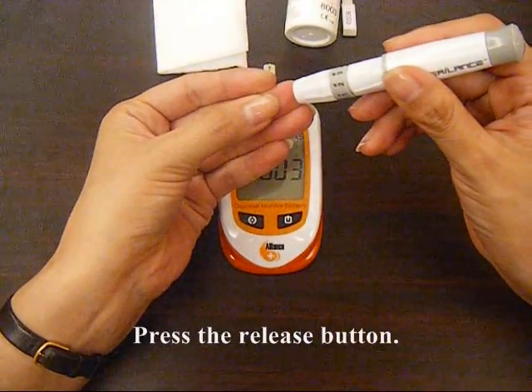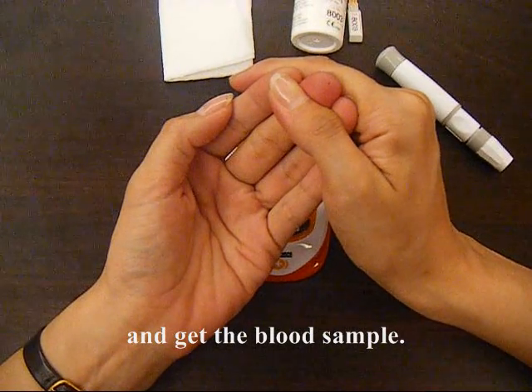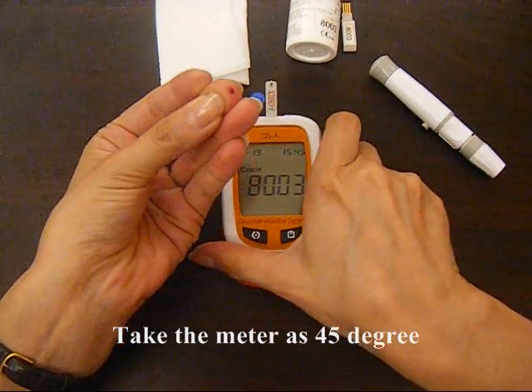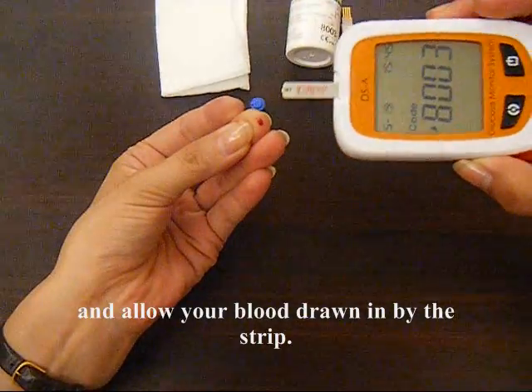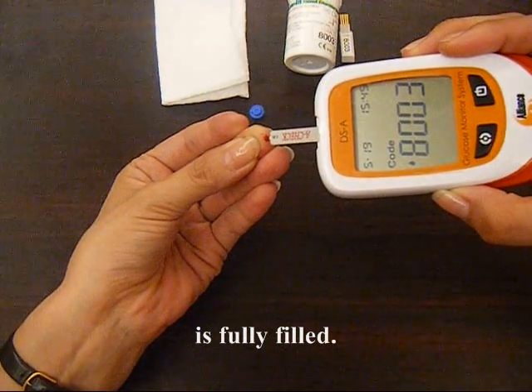Press the release button. Gently squeeze your fingertip and get the blood sample. Take the meter at 45 degrees and allow your blood to be drawn by the strip. Wait for a beep tone to ensure that the blood application zone is fully filled.